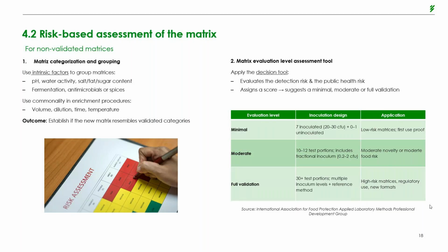In a nutshell, it is just a guide that helps us answer certain questions before going over the whole validation process that we know is very complicated and lengthy, or even before performing the analysis of a product, to ensure what we are doing is going to give us very reliable results.